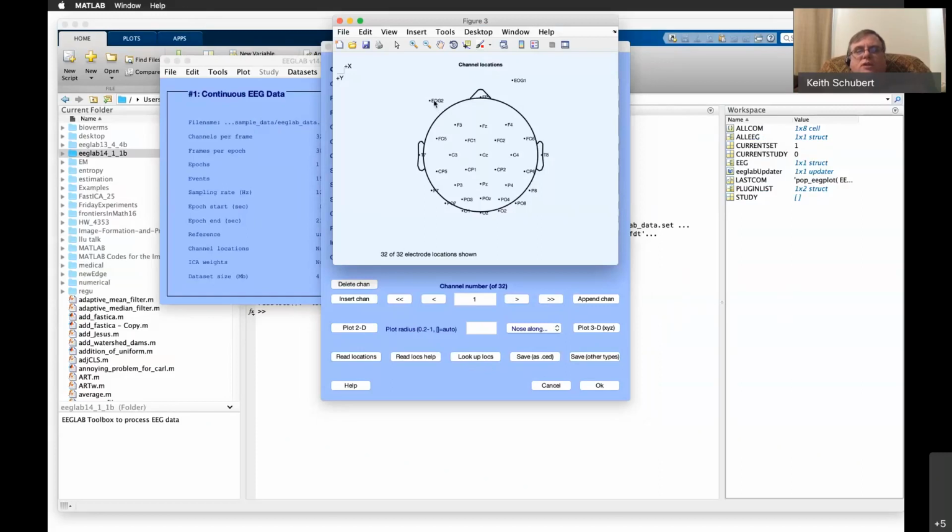So it does turn out there's electro-oculogram 1 and 2. So there are 2 eye channels, which is what I kind of thought. There is that prefrontal 0 that we had mentioned, frontal 0. So you can see the Z's running down the center. And I was saying that it might be temporal lobe 7 and 8, and it is. That's probably the ones that were 15 and 23 or whatever that was.